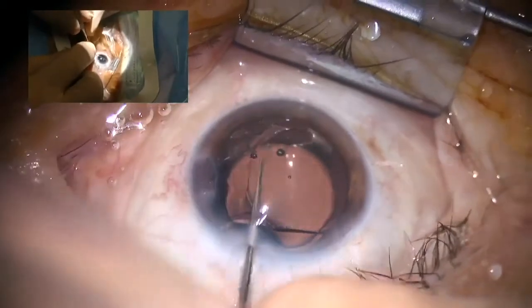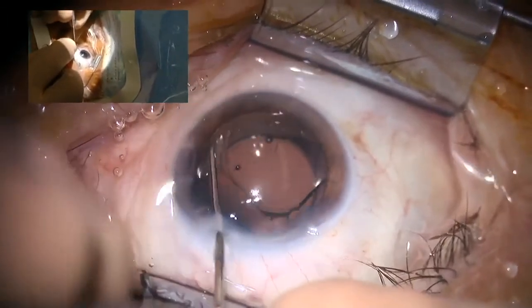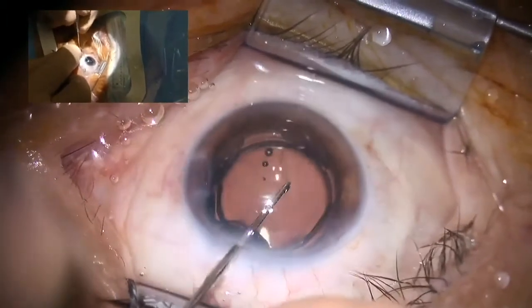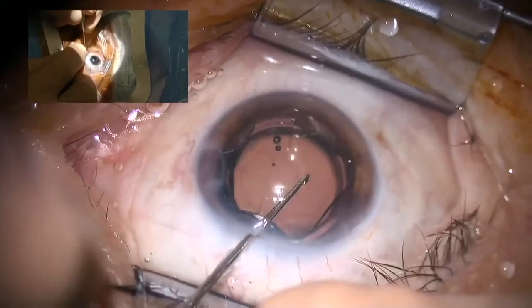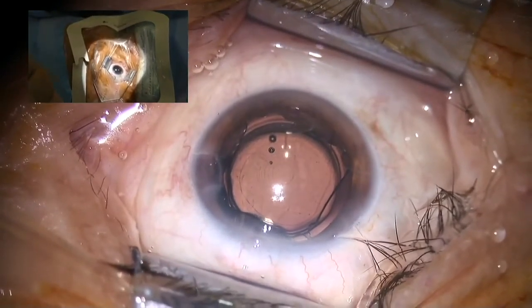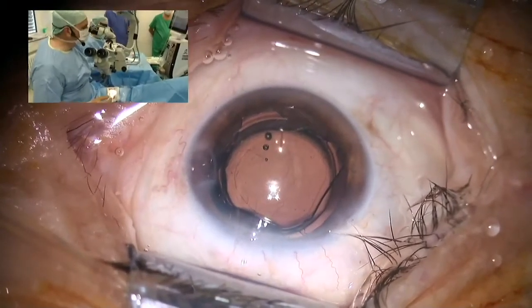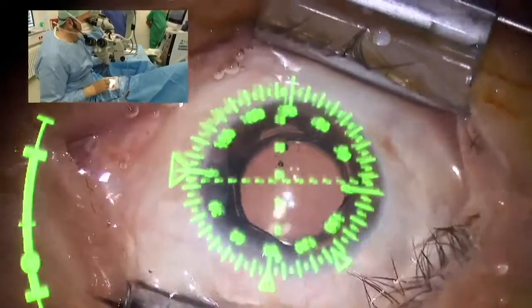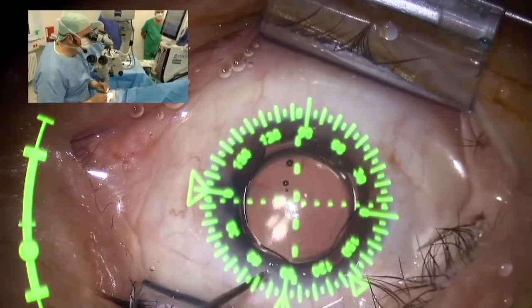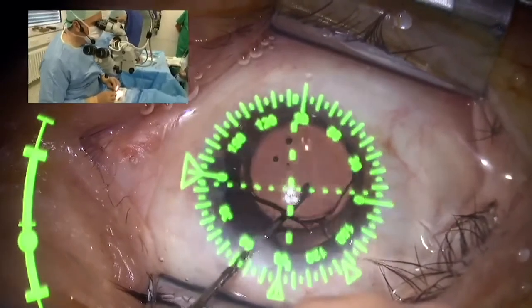Now you have to tell the patient that probably she realizes some, not pain, but the patient can probably feel it. So now the IOL is in the ciliary sulcus. It's very important to rotate it a bit. You saw that I rotated it during the implantation process because this ensures that the haptics are properly unfolded. Now we have to check that the implantation of the add-on didn't interfere with the axis of the underlying toric IOL, which is hardly the case.